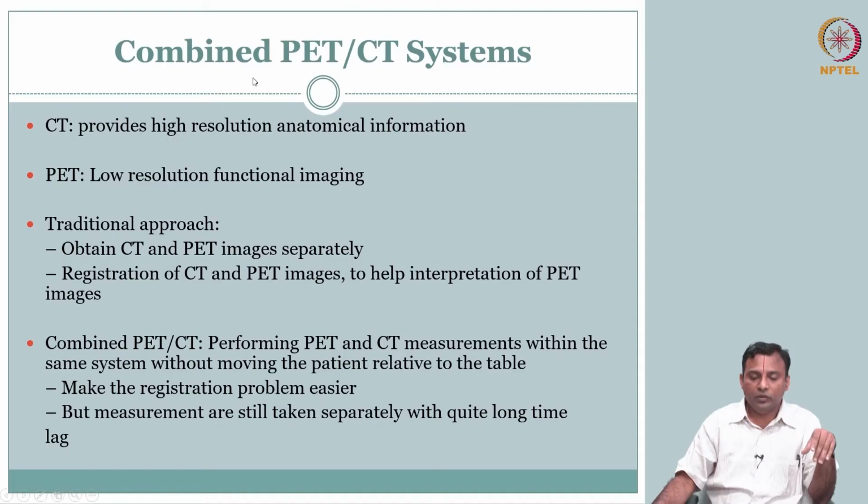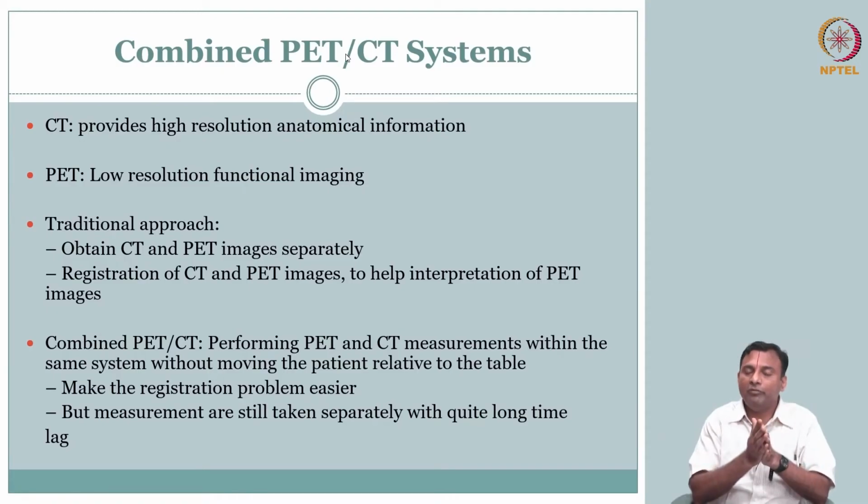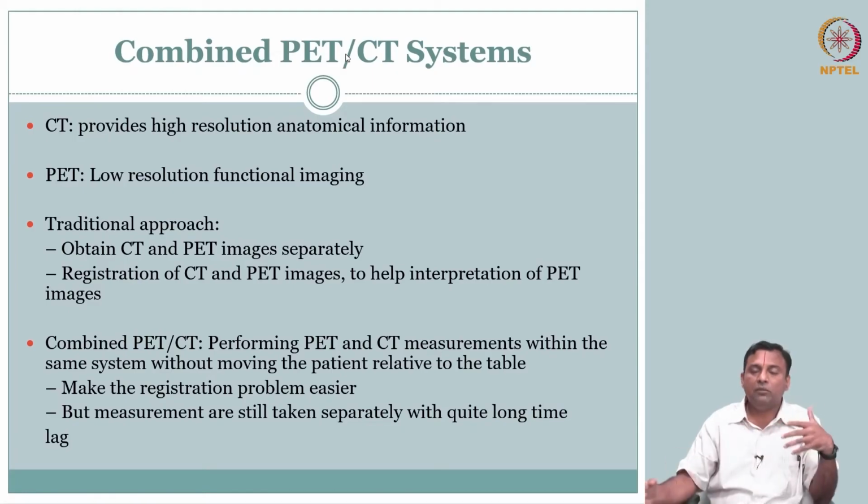fairly common nowadays to have what is called PET-CT. Remember, PET is a functional imaging system, whereas CT, as we saw, is good for structural imaging, and therefore they have found it to be very useful. They, as in the clinical practitioners, have found it very useful when you have both of them well registered, so that you see the anatomy and the activity there. That gives them a lot more insight into the clinical problem that they are trying to understand. So there are PET-CT instrumentations.